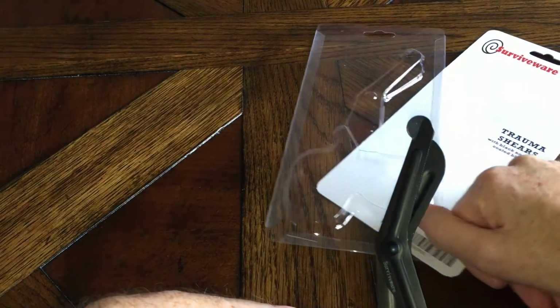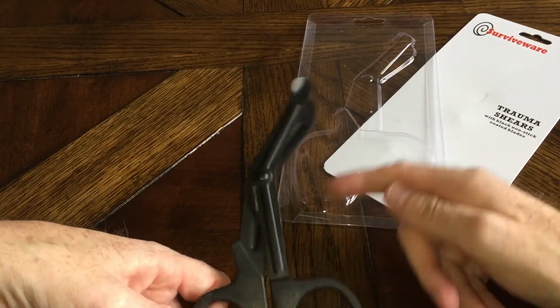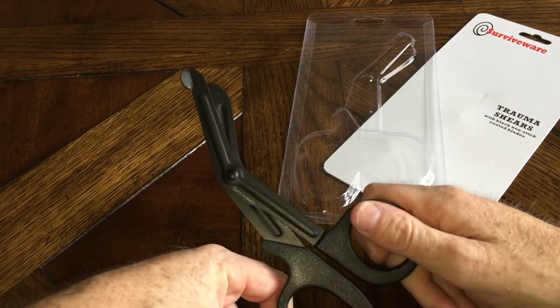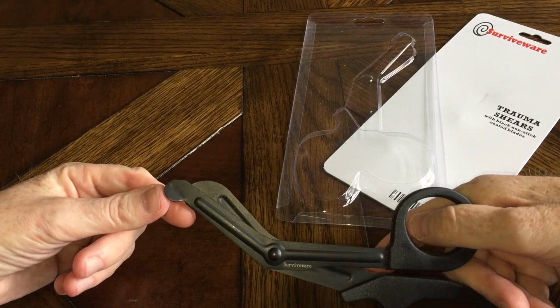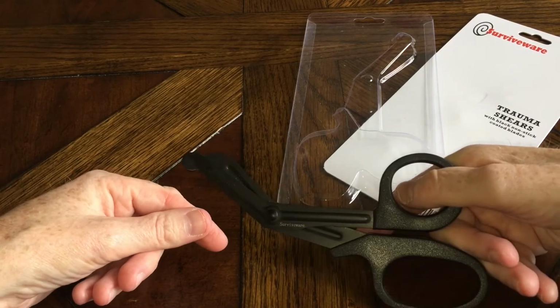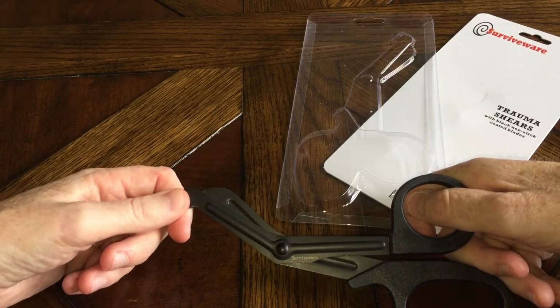So I'll take them out of the package. And it's got this thing at the tip. You can see that will prevent cutting of skin when you run the shears across, cutting clothing or fabric off of somebody.